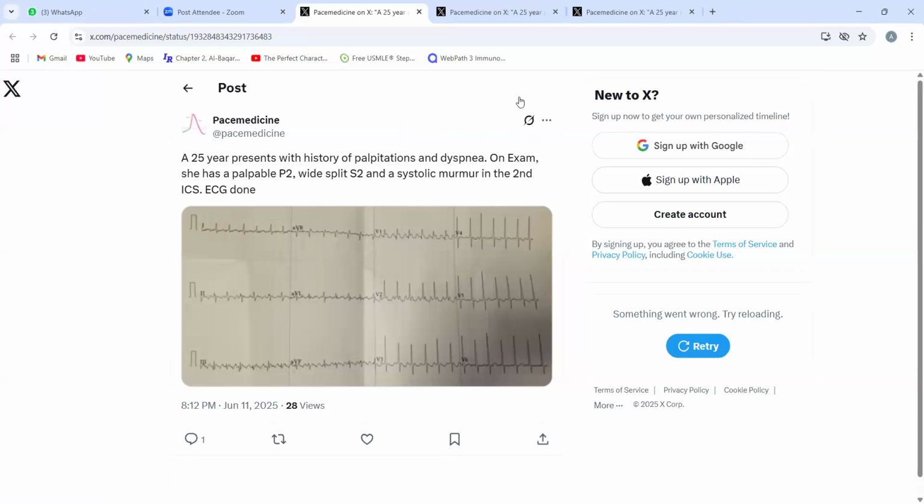You asked us if it was regular or irregular. I'm tempted to say regular. Yes. It's regularly irregular. Yes. So what you told us in the previous slide, in your teaching, is how you differentiate AFib and flutter.